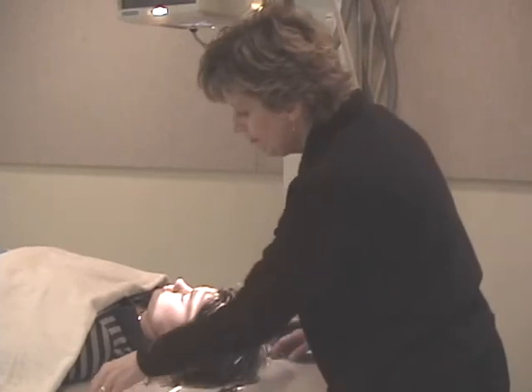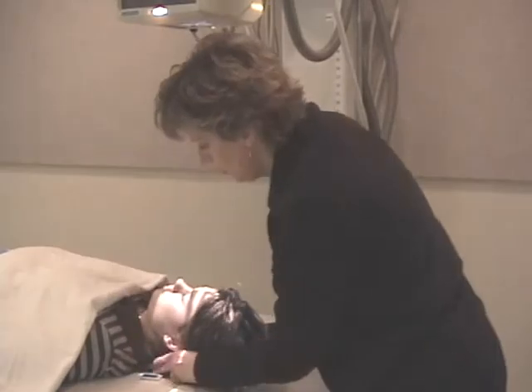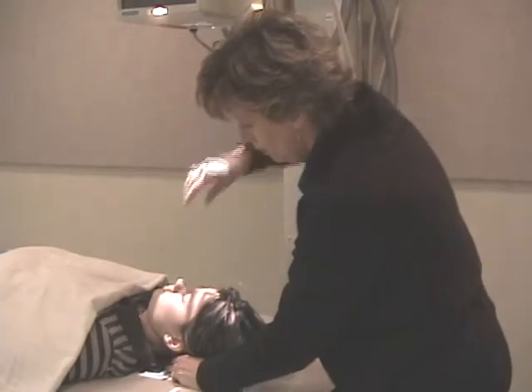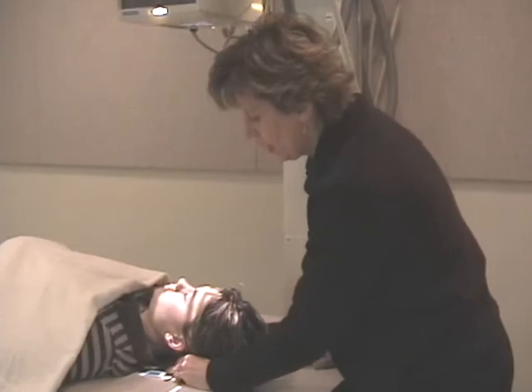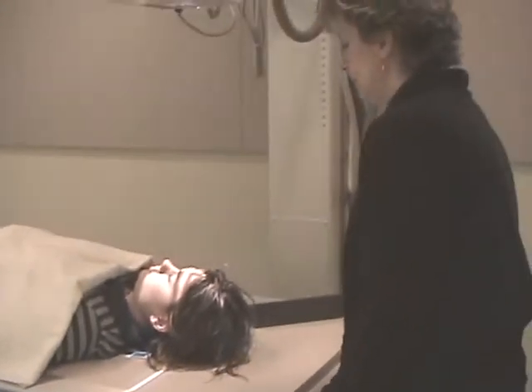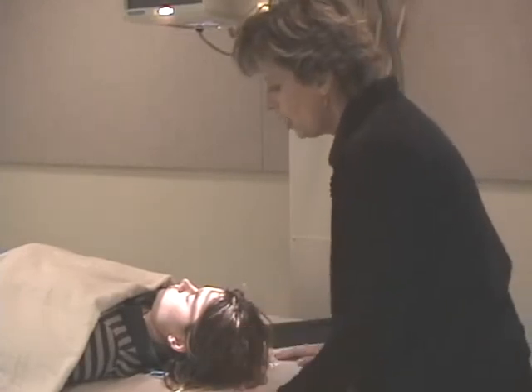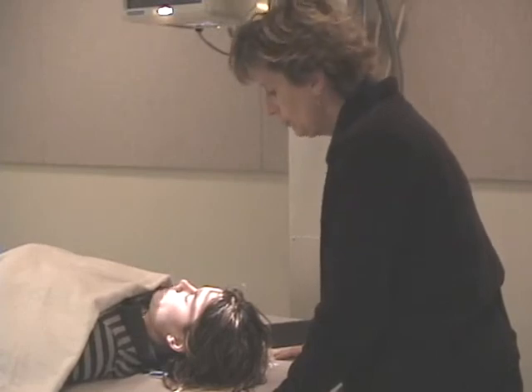And then I will place the left marker on her left side inside the collimated field here. Okay? And I think you can see that marker within the shadow there. Okay, tight collimation, the skull size will actually dictate how tight you can collimate. And then you would make your exposure.